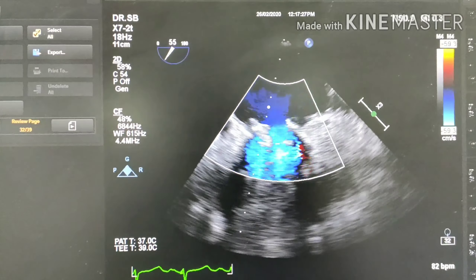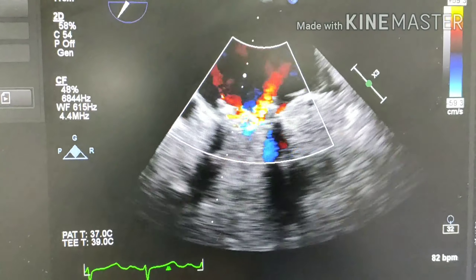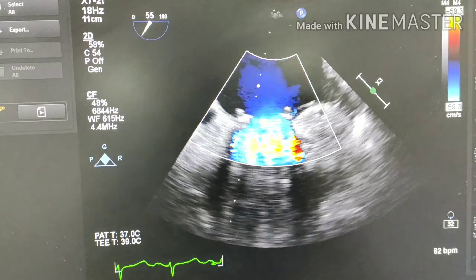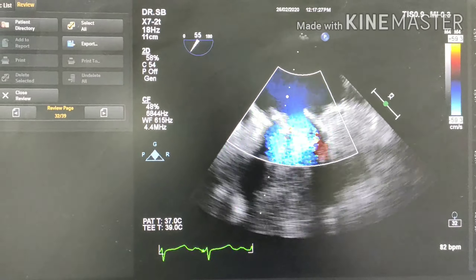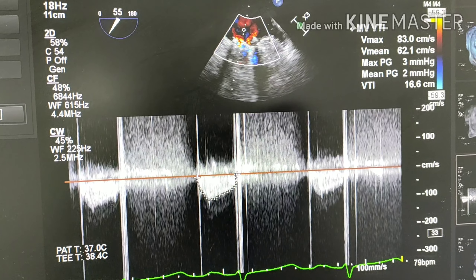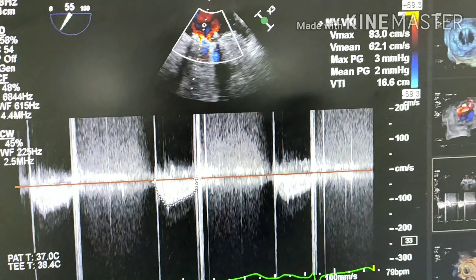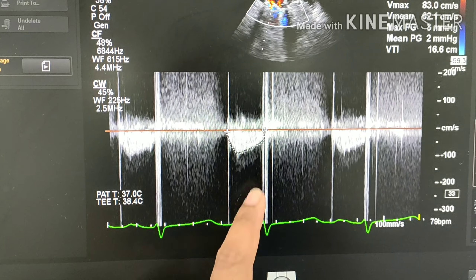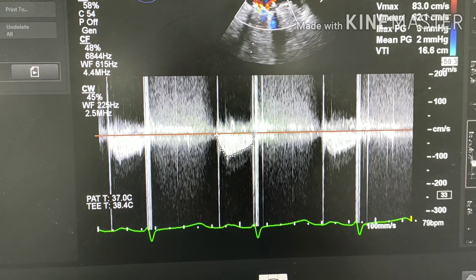A corresponding commissural view in 2D with color flow Doppler shows the normal washing jets and almost blue laminar mitral inflow without any significant turbulence, basically indicating that the gradient across the valve will be acceptable. Using continuous wave Doppler to quantify, the mean gradient across the prosthetic mitral valve in this case is 2 mmHg, which is normal — anything less than 5 should be okay. You can see the two parallel white lines of the bileaflet mitral valve opening and closing.